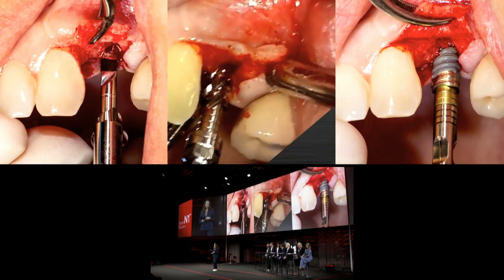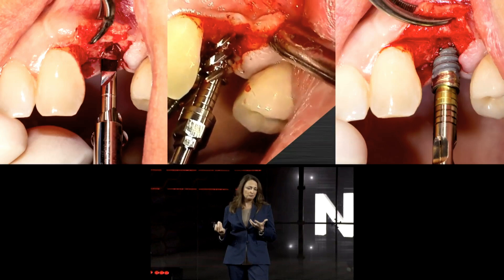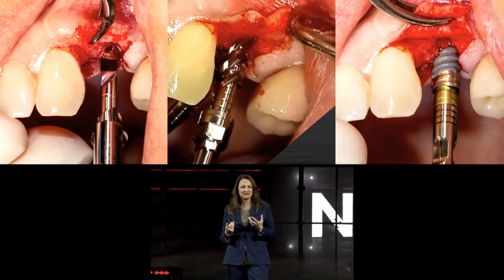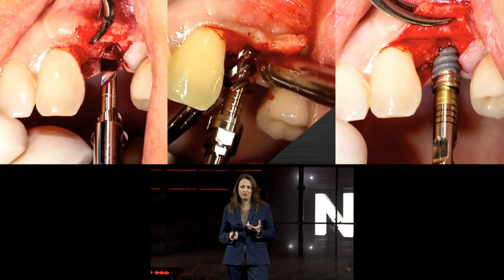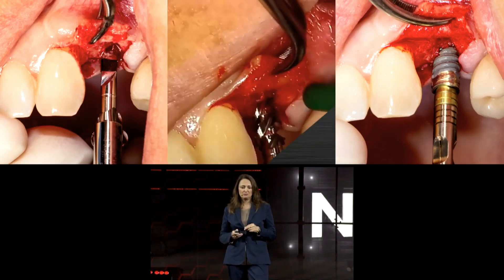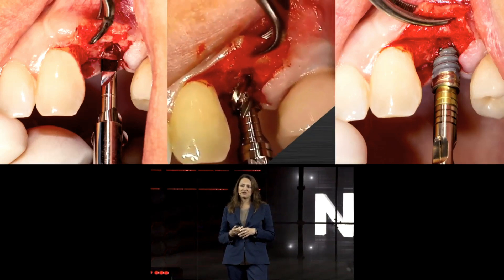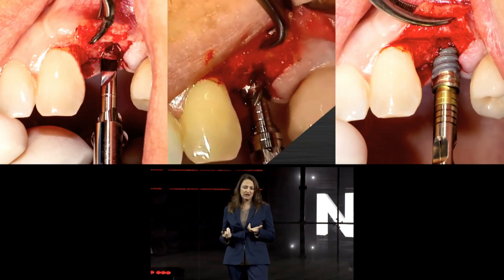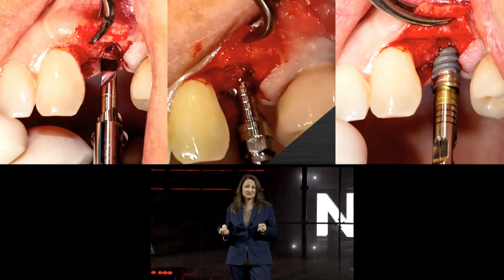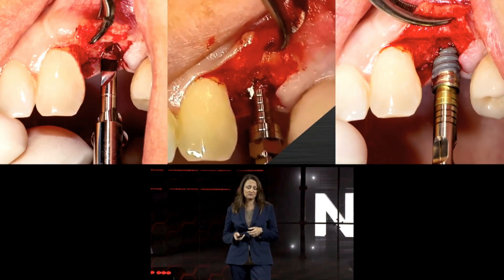Here the visibility of the engagement is very nice. In this bone quality of D4, the osteo-shaper is not bringing up as many bone chips as before. The performance of the osteo-shaper is without pressure on my handpiece, without pushing or pulling as we are used to, and without irrigation — which is extremely important for flapless surgery because this increases visibility.